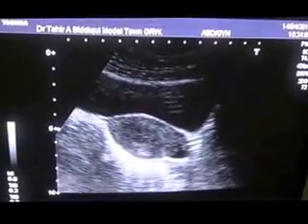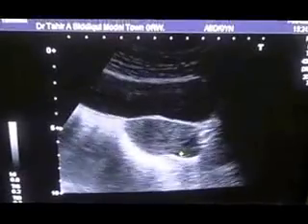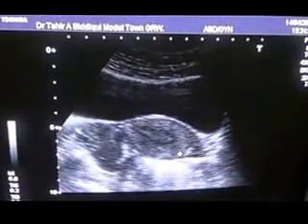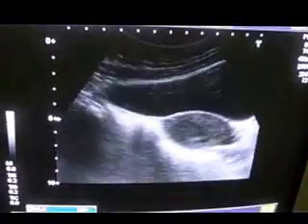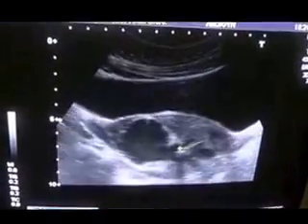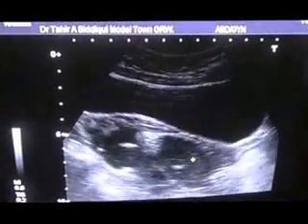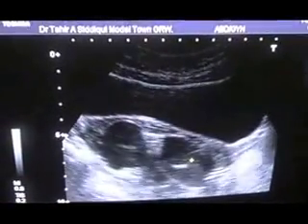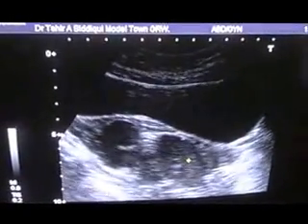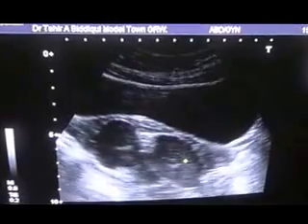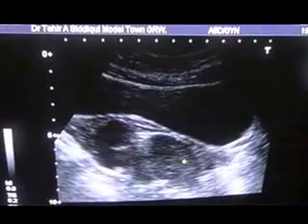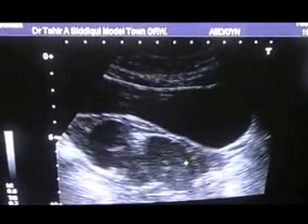This is a small amount of fluid — post-ovulatory fluid. Now, on the right, in the region of the right adnexa, what is seen is a tubular thick-walled cystic area with a strong back wall.